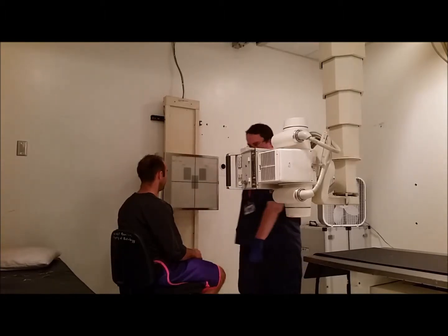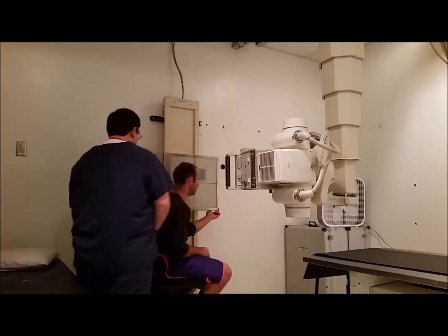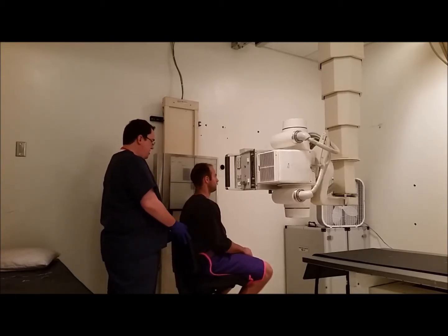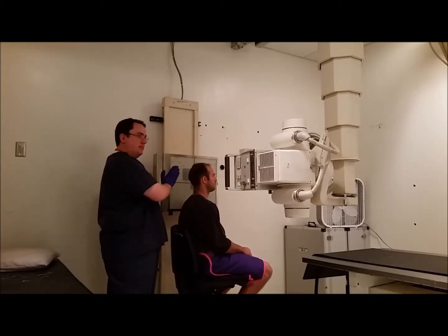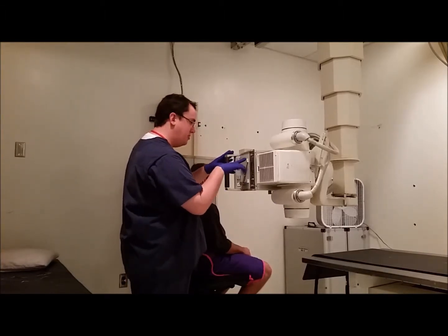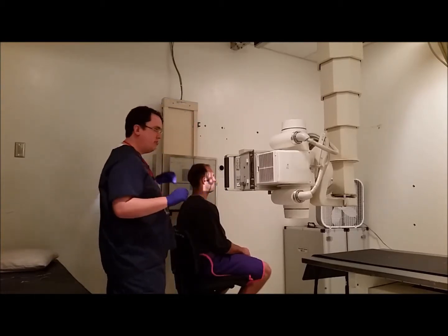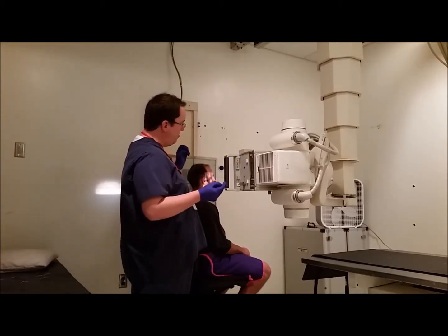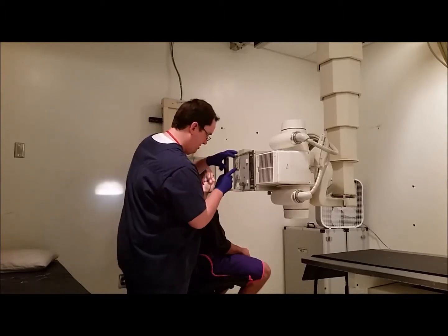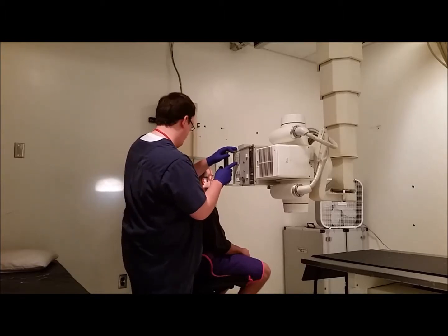Alright, there we go. We'll have you set up here for a lateral for our first view. Move you on up. Good lateral here. Rather have their head straight rather than them trying to bend it over to touch the board. Don't want to cause a rotation from that. Alright, so first is our lateral here. We want our CR to be directed about 1 inch posterior to the outer canthus. Alright, move that tube up a little bit. Bucky is lined up there.